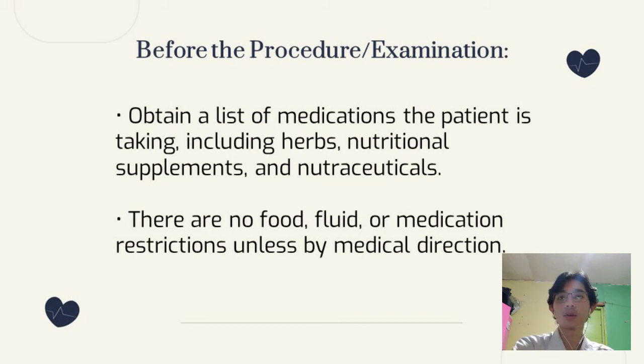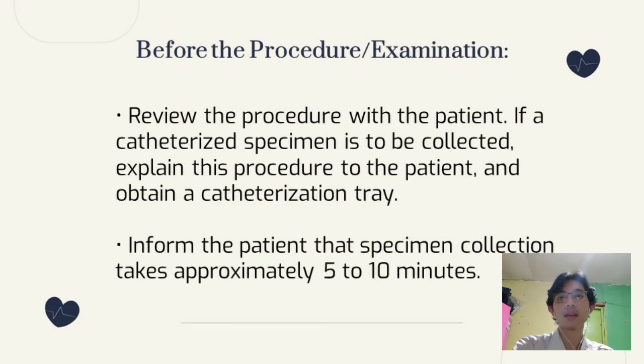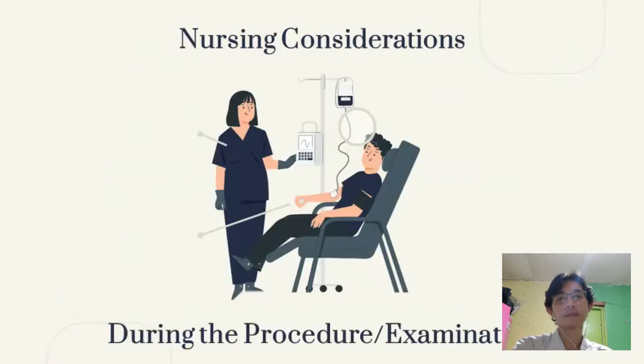Next, there are no food, fluid, or medication restrictions unless by medical direction. Next is to review the procedure with the patient. If a catheterized specimen is to be collected, explain this procedure to the patient and obtain a catheterization tray. And lastly is to inform the patient that the specimen collection takes approximately 5 to 10 minutes.